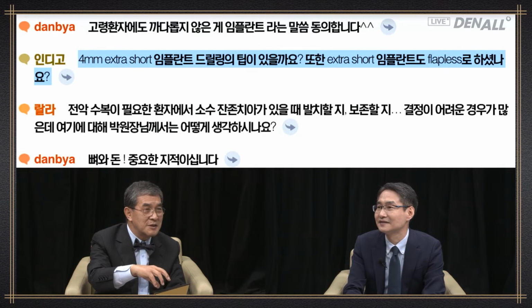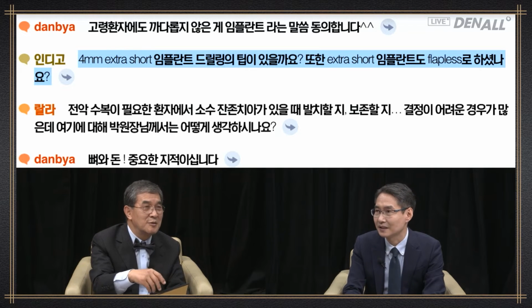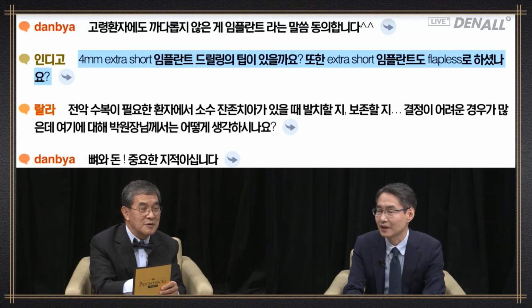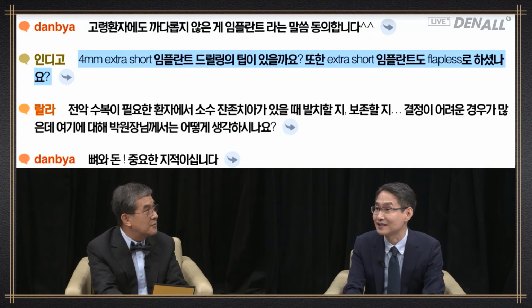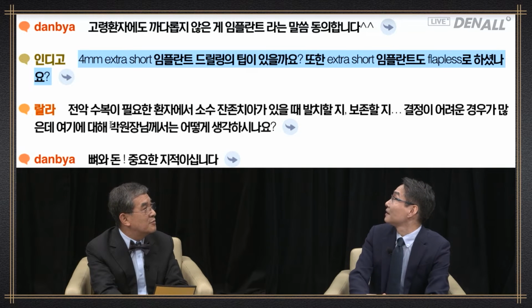When we do implant placement, we talk about 40, 50 Newton centimeter. We need to follow that rule. If it's too tight, there can be compression on the bone and it can lead to bone necrosis. I believe that 40 to 50 Newton centimeter is ideal.